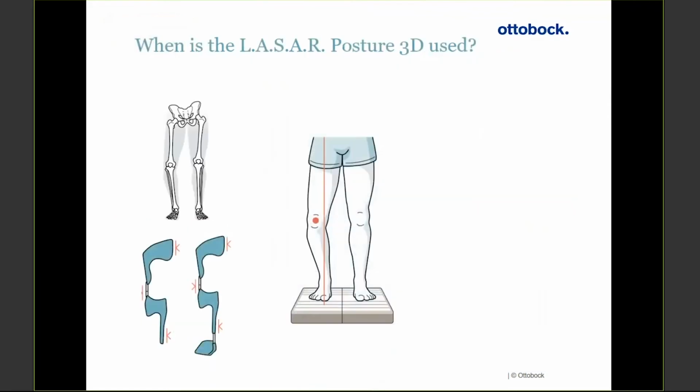For orthotics, it's going to be slightly different. We don't have a bench alignment. So we are assessing our patient, and then depending on what we find, we're going to design a device. We're going to decide whether the patient needs an AFO or a GRAFO or a KFO, whatever it might be. And then we're going to design this with the appropriate position of the shells, whether they need anterior, posterior shells, or where the joints or what type of joints they need.